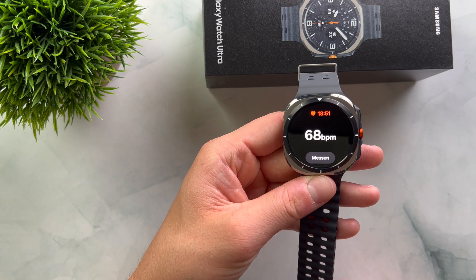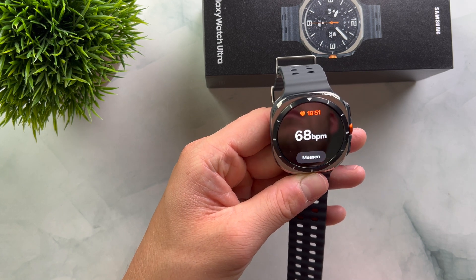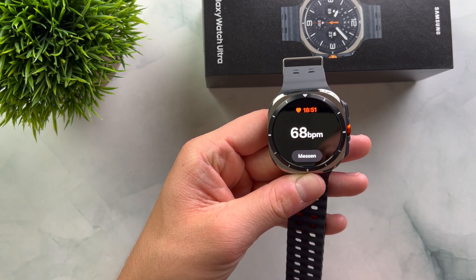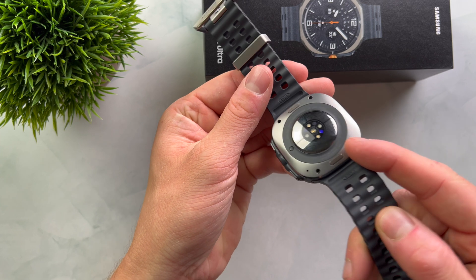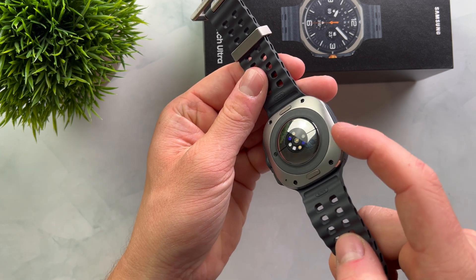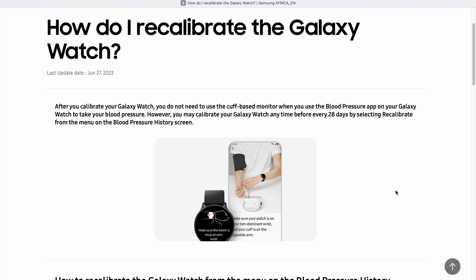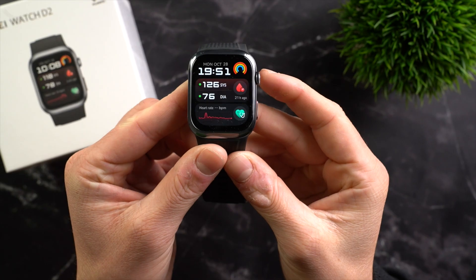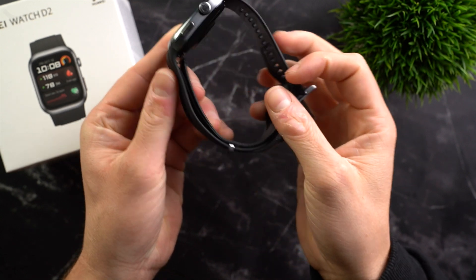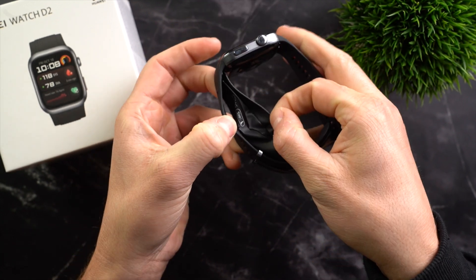Some smartwatches like the Samsung Galaxy watches also offer a blood pressure feature, but in my experience their measurement is often unreliable. They do not use a traditional blood pressure cuff but rather LED lights, similar to how these watches measure heart rate. Additionally, you need to calibrate them with a blood pressure cuff before the first measurement and then recalibrate every 28 days. However, the Huawei Watch D2 is a smartwatch that can be comfortably worn on the wrist but also has a built-in cuff that inflates.